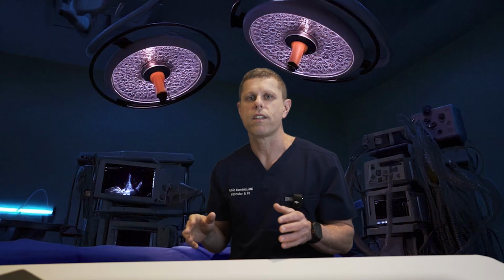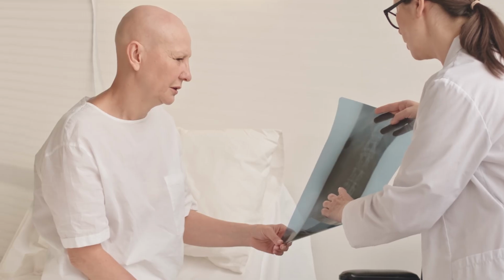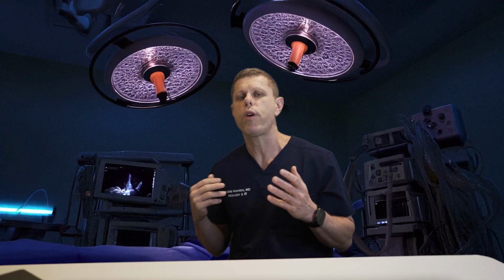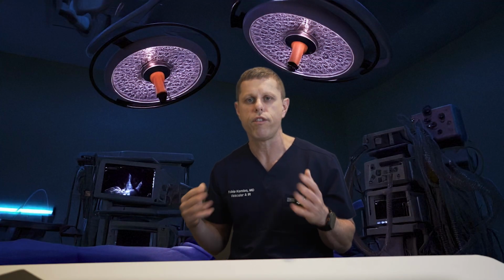In most patients, the filter is just a temporary solution for a short period of time, and once the patient recovers and is back to normal and tolerating blood thinners, the filter usually can be removed. There are exceptions. Let's say a patient has a terminal cancer with brain metastases, they're at very high risk of bleeding. Those patients are probably keeping the filter forever. But in practice, we essentially remove almost all the filters we place. So that's why if you had a filter placed, you should always follow up with us in a few weeks so we can make a decision of if and when the filter should be removed.